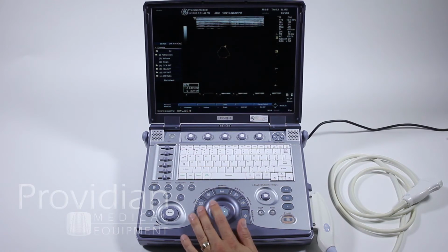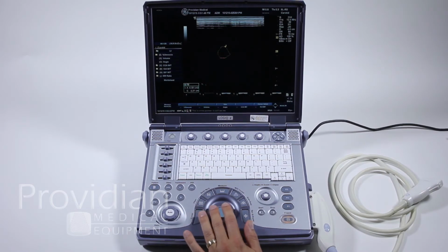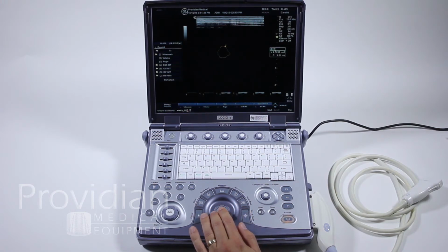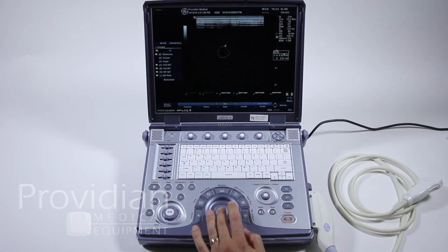Now the results box is positioned in the lower left hand corner. If I want to move that, I can take this cursor, click, and drag it around the screen and place it wherever I want. So you'll notice this here, and this will also hide the menu to make it smaller. So you hit the cursor and then the set key on the top part of the box in this area to move it. Go ahead and hit clear.